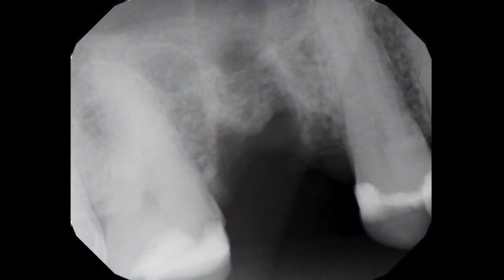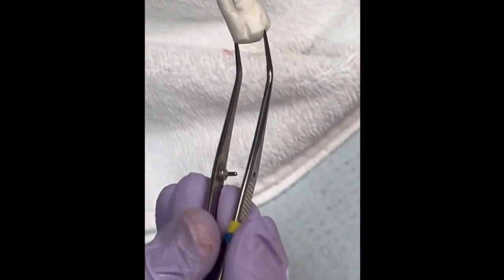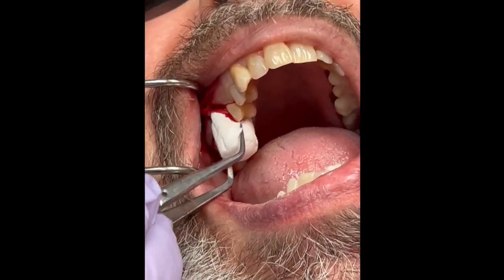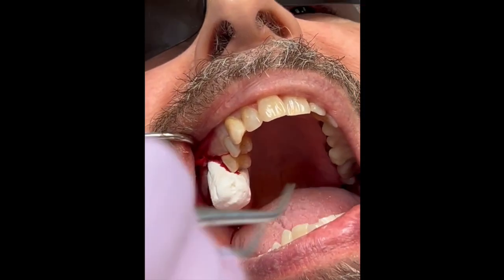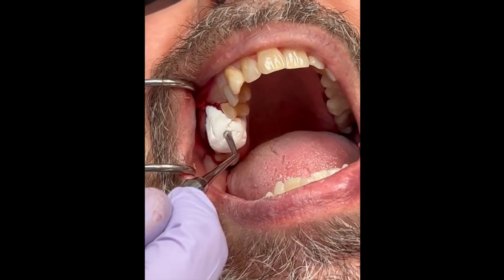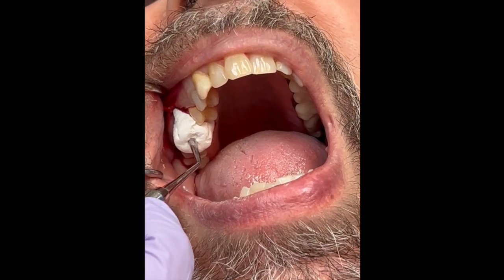You can see the trauma created with that tooth. We take a radiograph to ensure the tooth is removed in total. I took a large osteogen plug, shaped it like the tooth roots we're replacing, and I'm going to slowly position it into place and pack it firmly into the three sockets to the crest or slightly above the crest of the ridge.